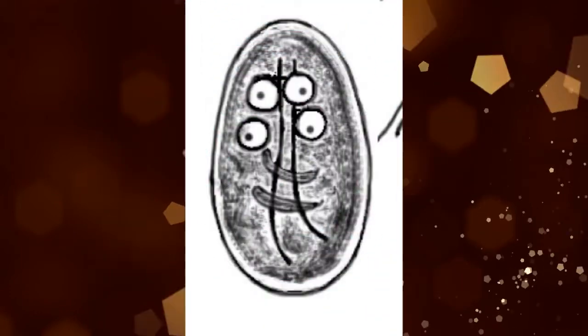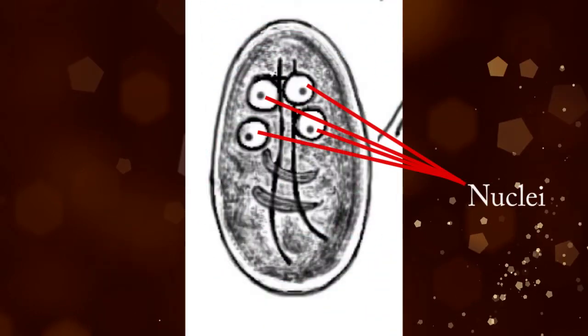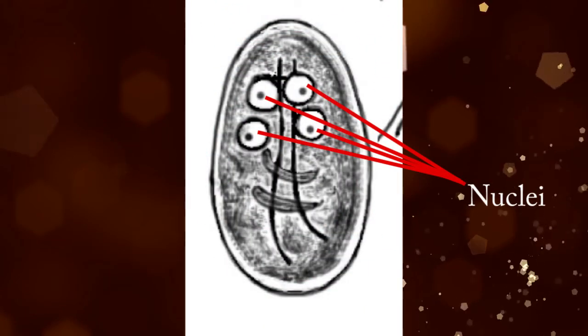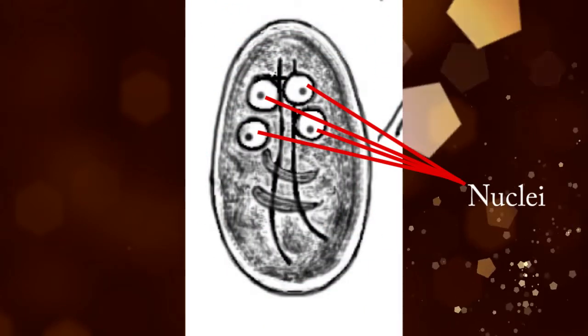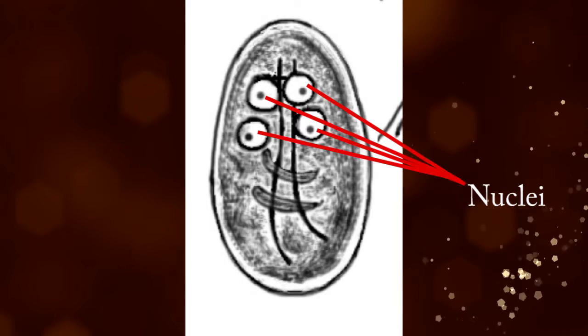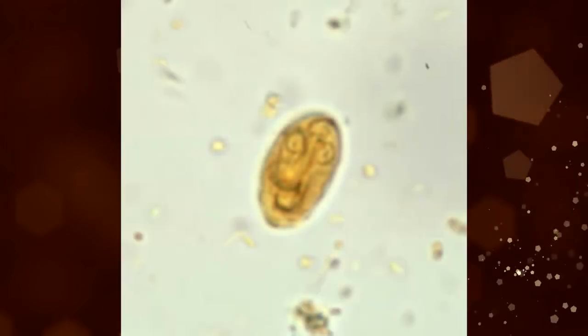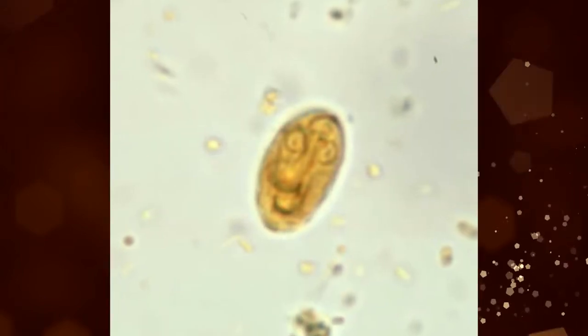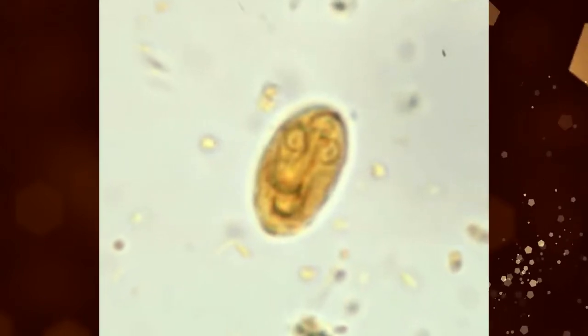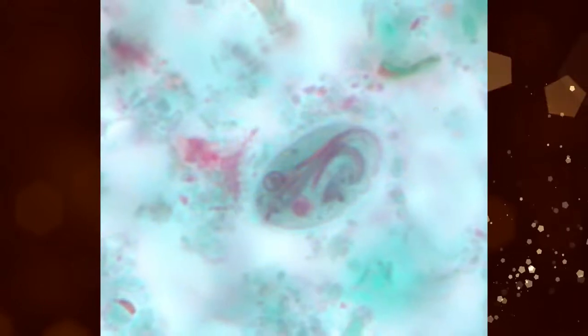Mature cysts have 4 nuclei, while immature cysts have 2. Nuclei and fibrils are visible in both iodine-stained wet mounts and trichrome-stained smears.